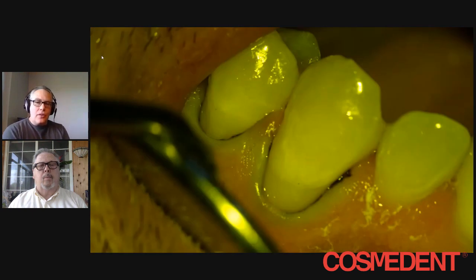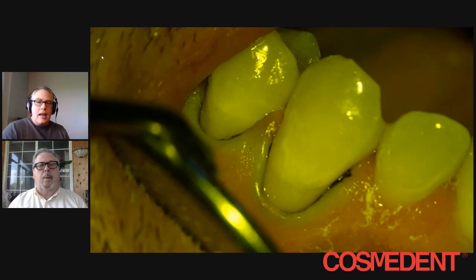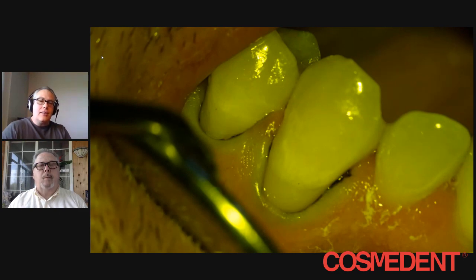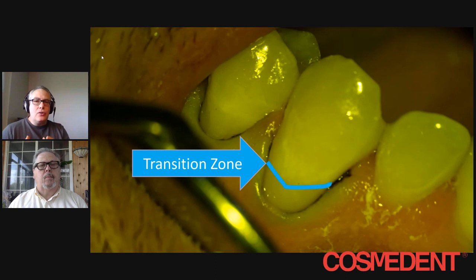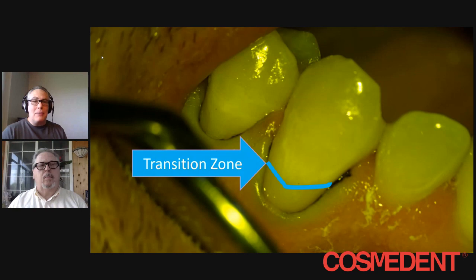Starting here — the first thing I like to do in these class five restorations is place a cord. Once the cord is placed and I etch and bond the tooth, and sometimes I'll place a liner — in this case I use an RMGI as a liner — the next thing to address is right here: the transition zone. That's the transition zone from the extent of the lesion to where you want to blend it. The problem is if I use a translucent composite, it's going to become very visible, and secondly, it may look very, very gray.